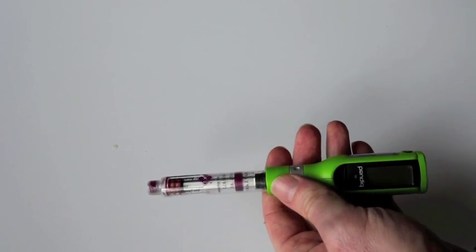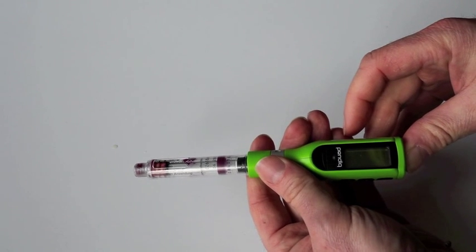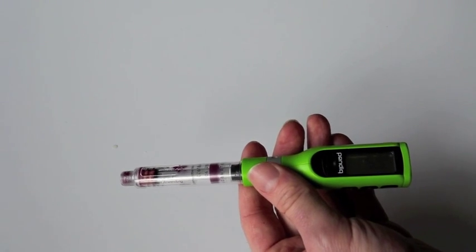So now the next thing we have to do is we have to turn it on. One, two, three — okay, it's on. You see I only have five and a half units there, so I'm going to just throw that away.